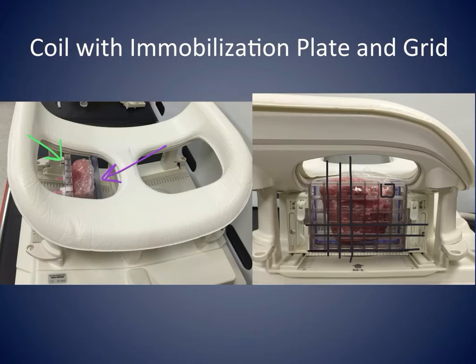The grid size and the number of rows and columns vary with each coil system. Two concepts are important for breast positioning within a grid: to place the grid to cover the area of interest where the lesion is, and to immobilize the breast, avoiding tight compression that may impair blood inflow.